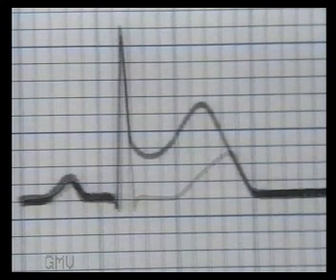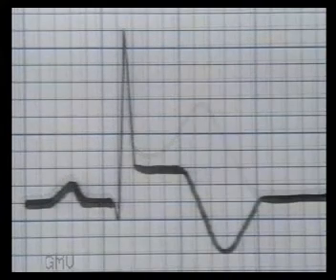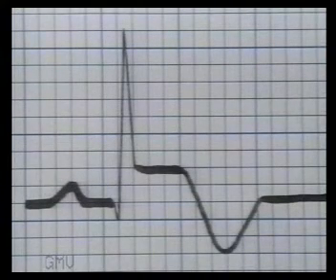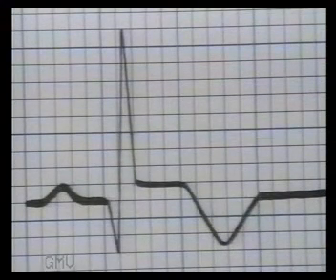On the first day, the ST segment will be elevated with upright, tall T wave but no Q wave. Over the next 2 days, the T wave will slowly become inverted. ST segment is still raised. Towards the end of the first week, the ST segment will be returning to the base level. The T wave will be deeply inverted and Q wave starts appearing.